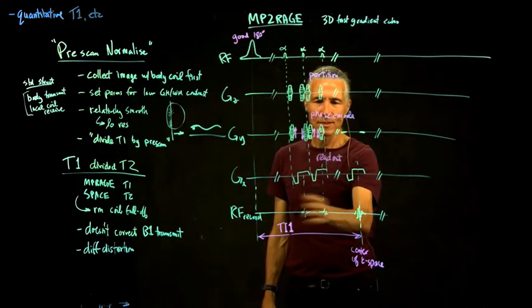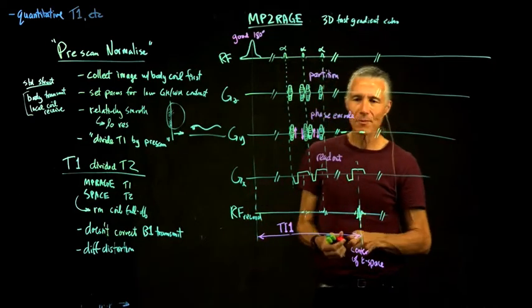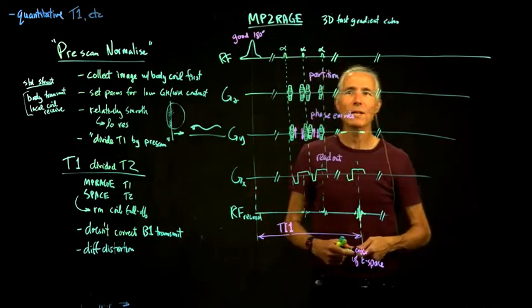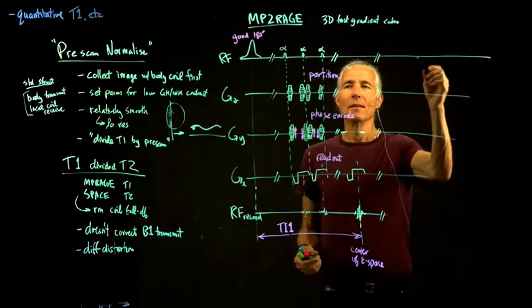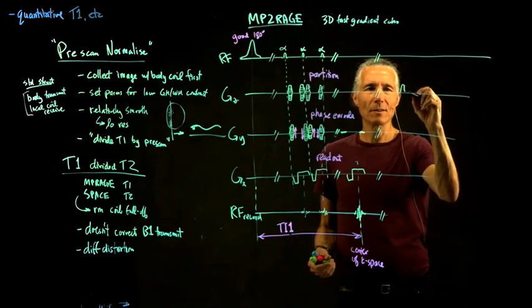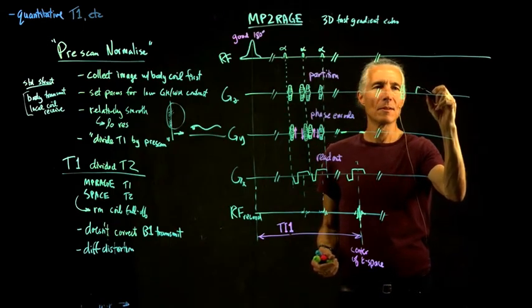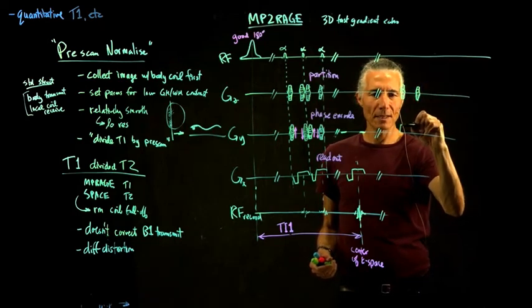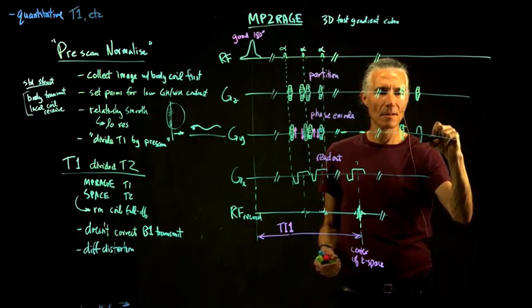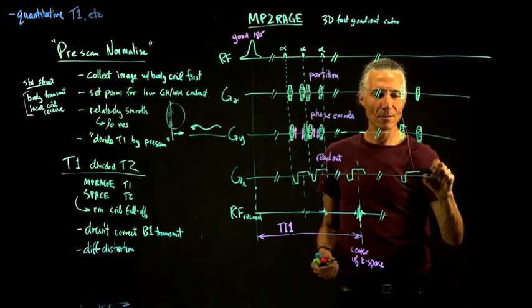So we do like 100 readouts here to get a whole bunch of lines of K-space, and then we just collect another one. So now there's a whole another one. So basically the same thing over here. So just go again with the same set, pick one partition, go through all the possible combinations of phase encode, do a zillion readouts.